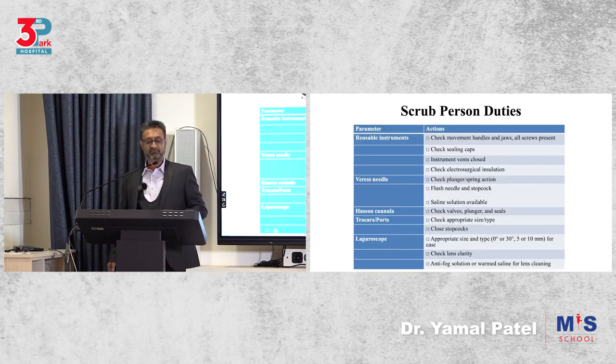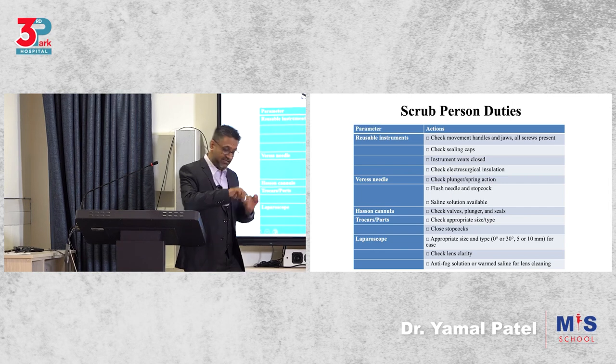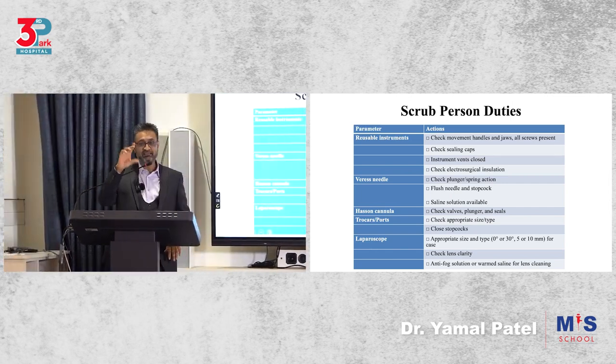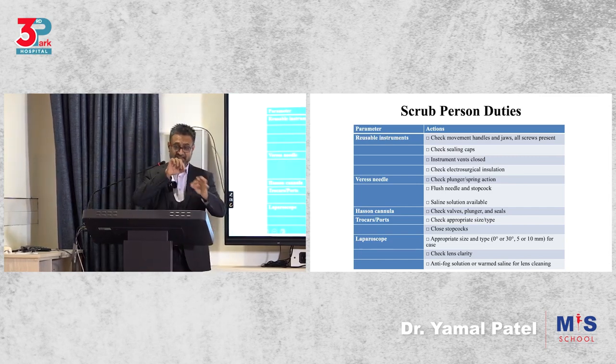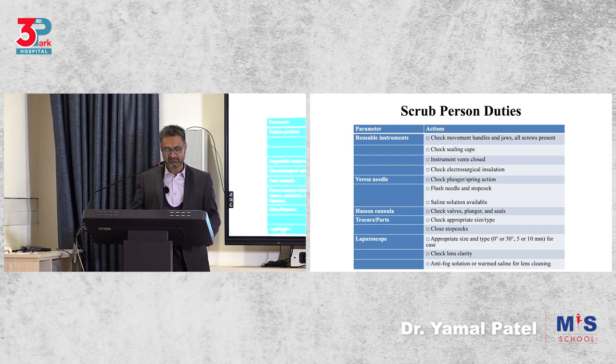What about my scrub person? My scrub person's checklist could be the following. Did I check? Did I connect my instrument? Did I see it's open? Is my insulation correct? Is it opening and closing? Is it not at the last minute when I ask for it? So is the Veress needle spring okay? Is it patent? Is the valve opening? So you're checking all this before you start. Okay, that's called a checklist.